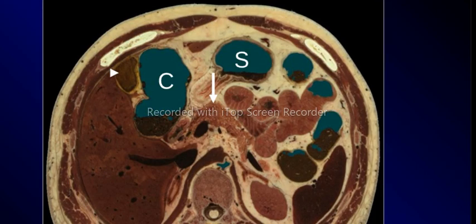Further down, this is still your diaphragm. This is the collapsed aorta. Then here we have your IVC. This is the left kidney beginning to show. And then we have the spleen there, splenic flexure, stomach, hepatic flexure, a small bowel. This is pancreatic body. The neck is here, beginning to show a bit. This is your gallbladder. And this is your liver getting smaller as we go down.